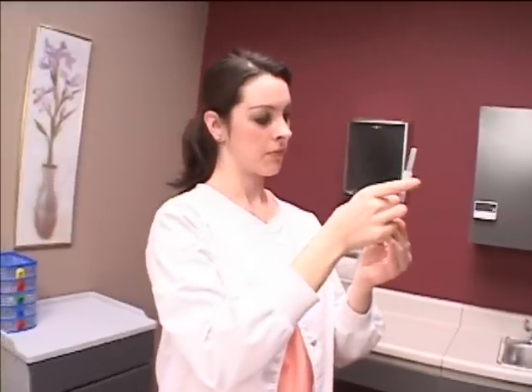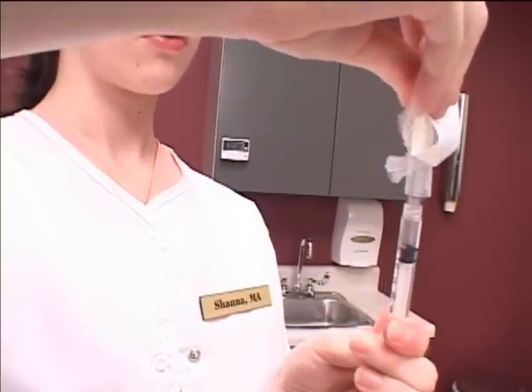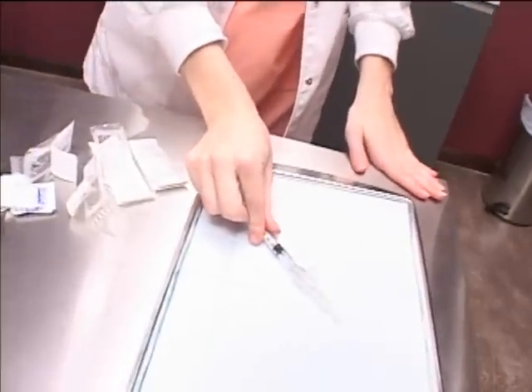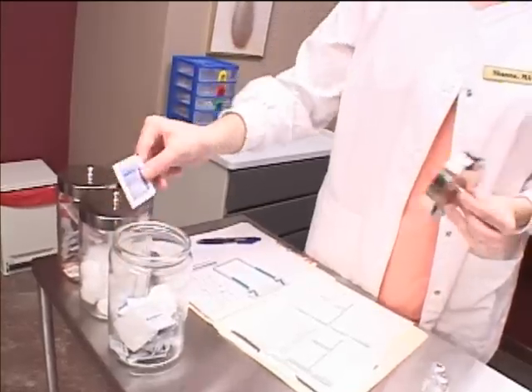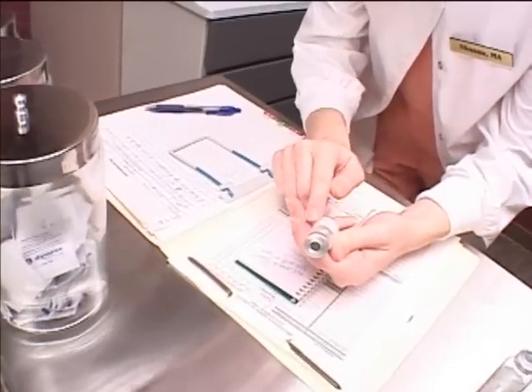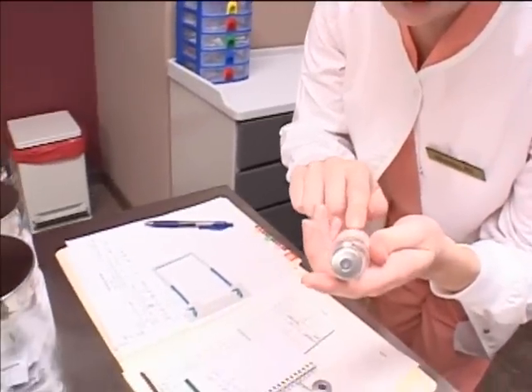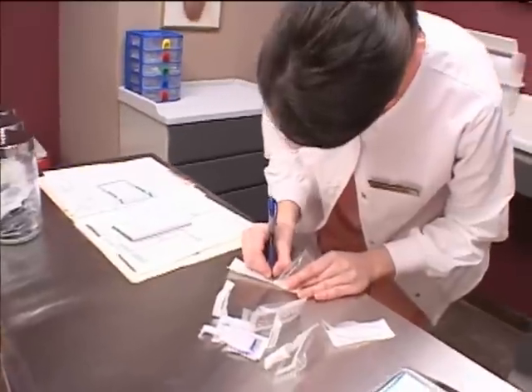Remove any air bubbles by gently flicking the syringe and change the needle if appropriate. Place the syringe, cotton balls, alcohol pad, and adhesive bandage onto a medication tray. Recheck that you have the correct medication one more time prior to returning the vials.